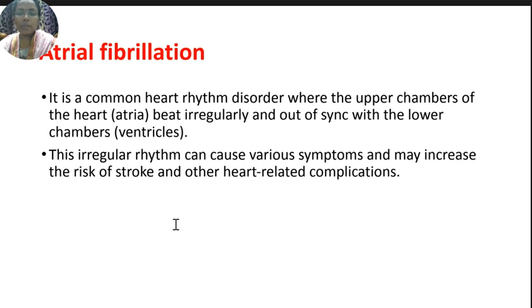So next, the final segment is ST segment abnormalities. I already discussed the ST elevation. The common cause is ST elevation. If any elevation in the ST segment is present, there is a high possibility of myocardial infarction, that is acute myocardial infarction. We can commonly call it a heart attack.